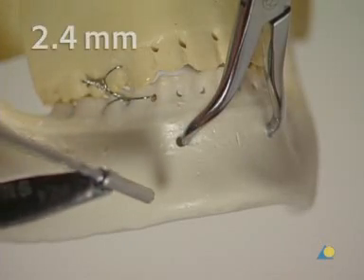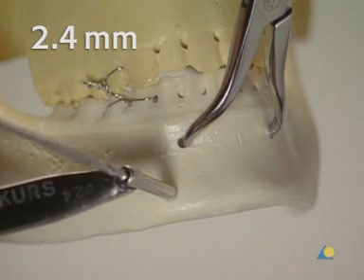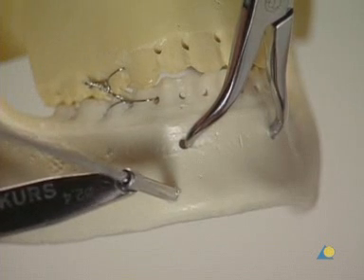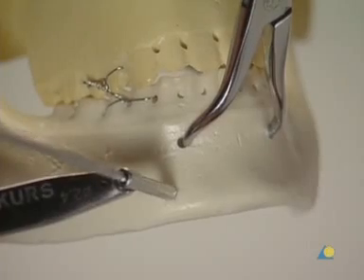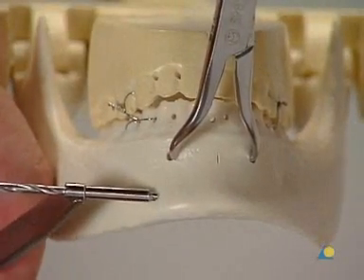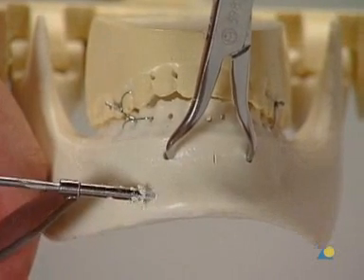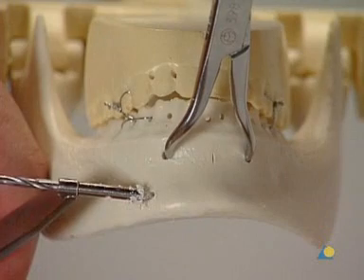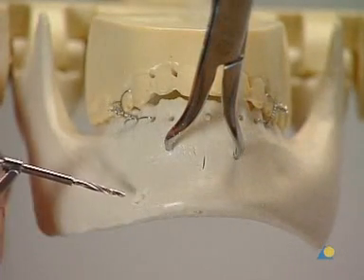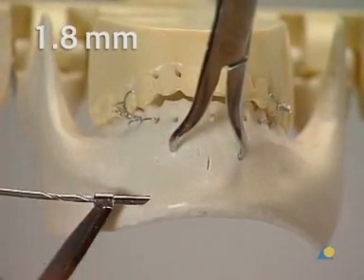The 2.4 mm glide hole is made near the inferior border of the mandible in the canine region. The drill guide is placed perpendicular to the bone to avoid slippage. The drill is then redirected perpendicular to the fracture line. The drill path must not break through on the lingual cortex of the mandible. Next, a thread hole is drilled; the 1.8 mm drill guide is placed into the glide hole.